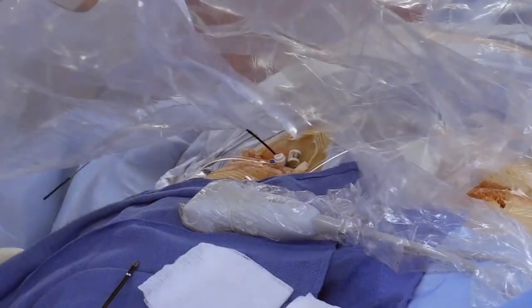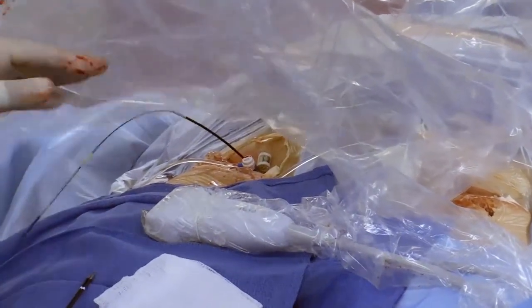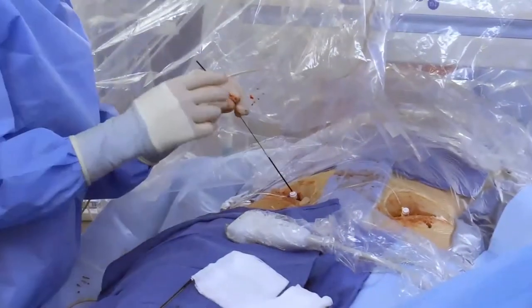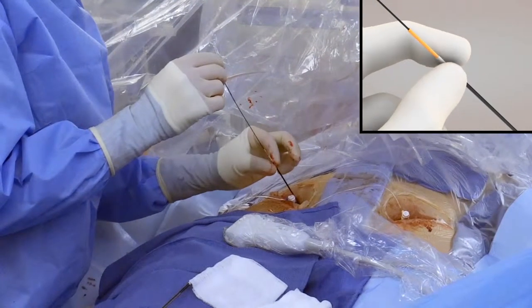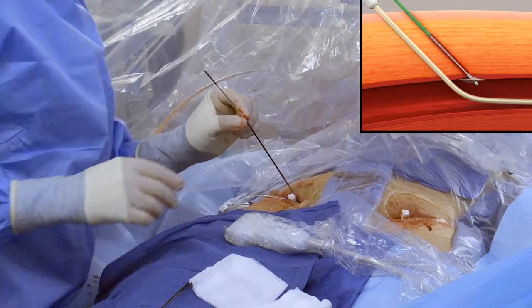The black sleeve with a locking mechanism prevents inadvertent collagen exposure. To expose collagen, remove the clip and unlock the sleeve by sliding the orange-blue key into the lock until the blue segment is no longer visible. While holding the lock, retract the sleeve and allow 30 seconds of dwell time for collagen hydration.